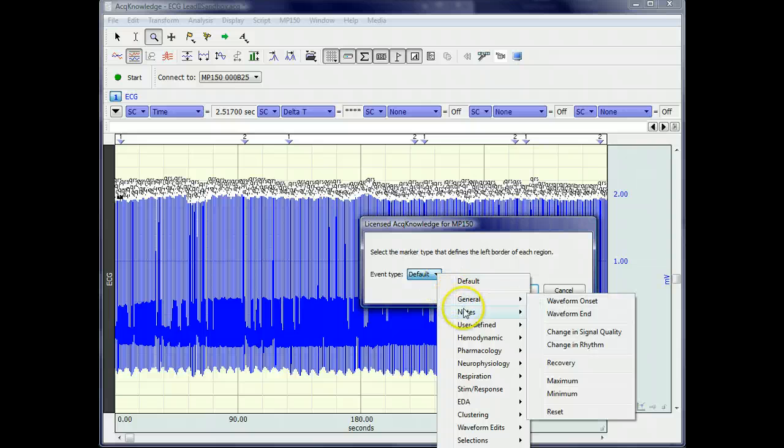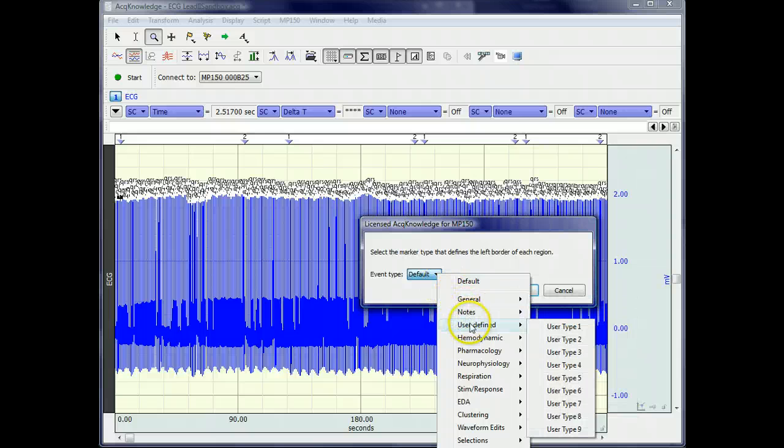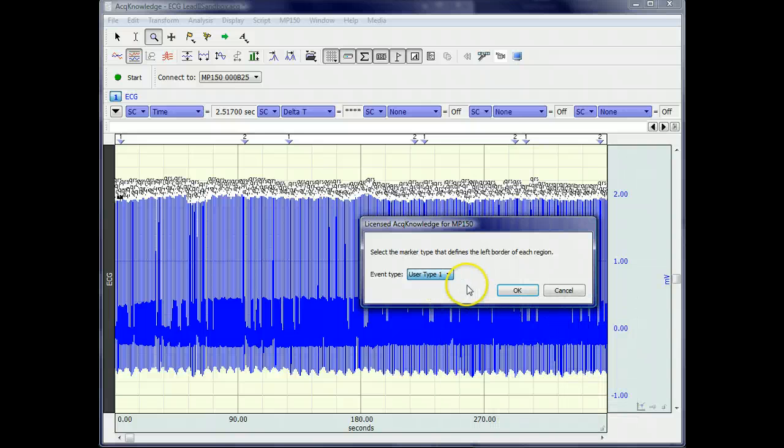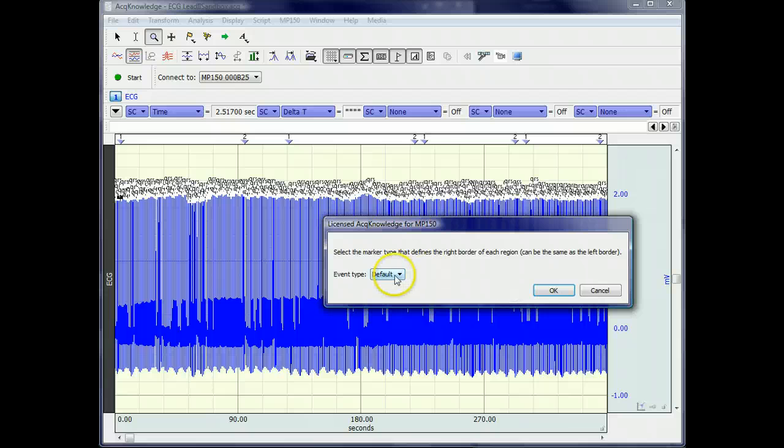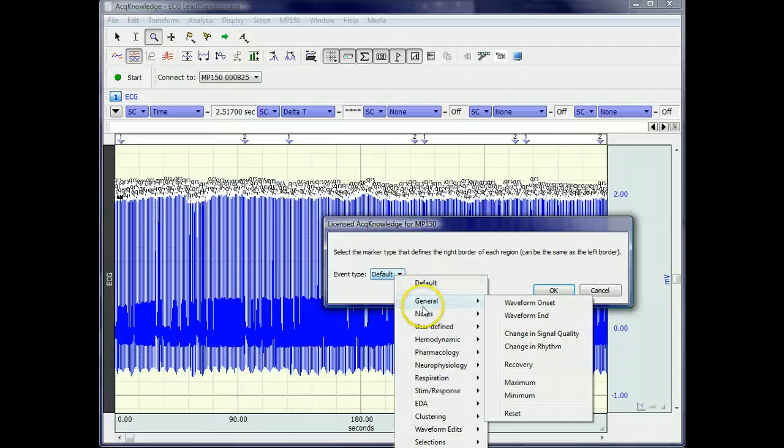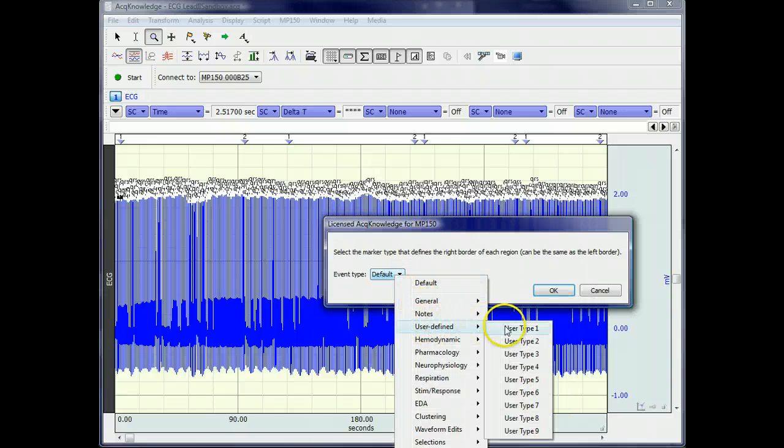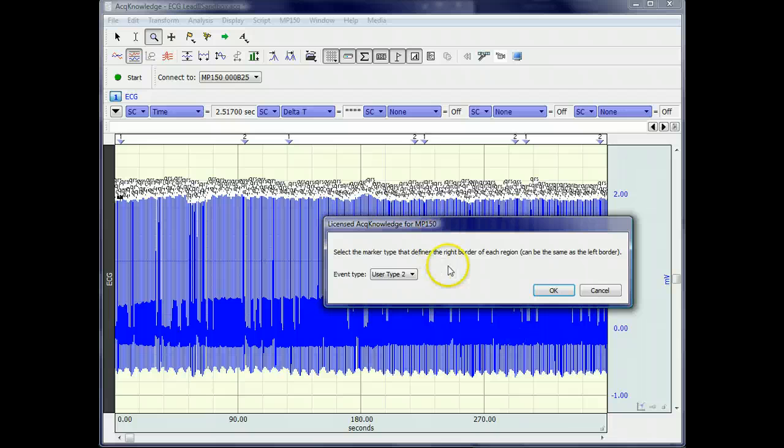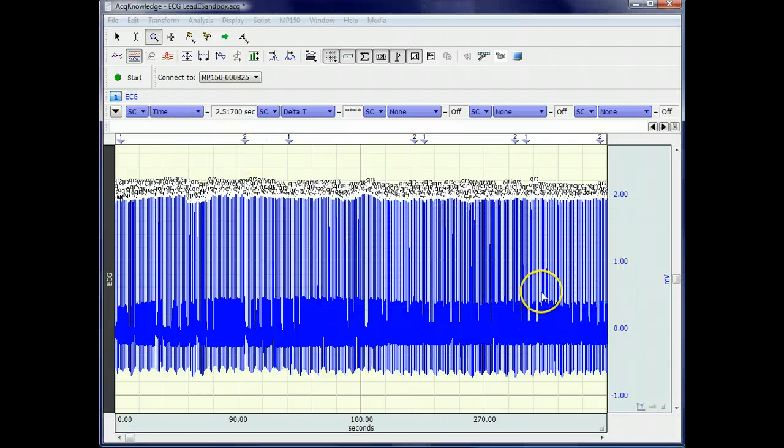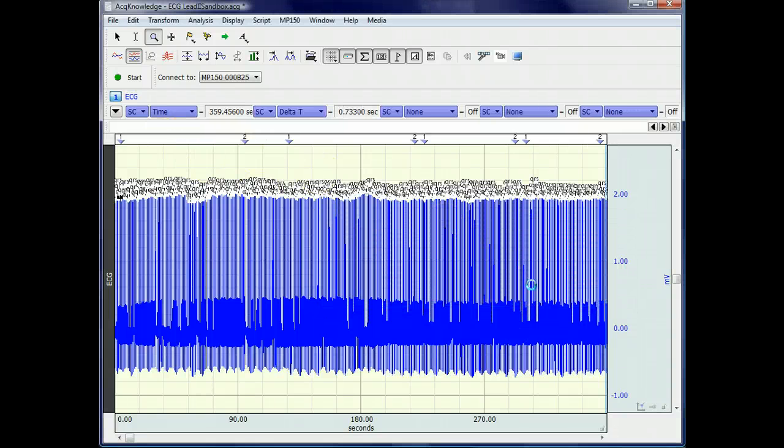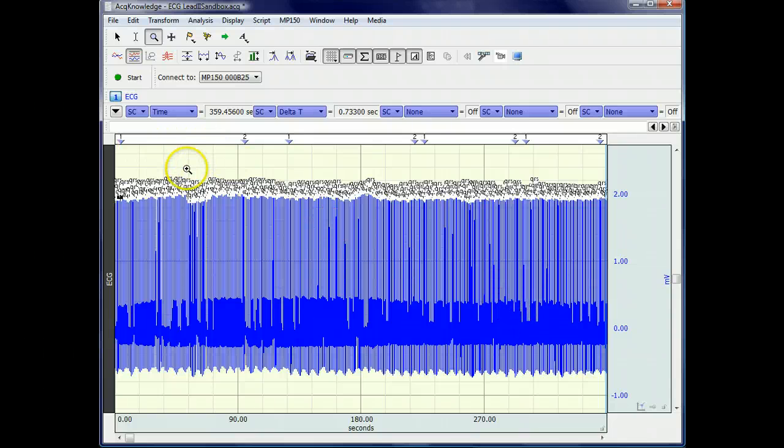You could make this more efficient by hard-coding the specific type of events that you want, or you can leave it, as the script is currently written, very general, so that each time a new user comes along to use the script, they have to specify their events. But once you've specified them, then the script automatically computes the HRV statistics in these intervals.